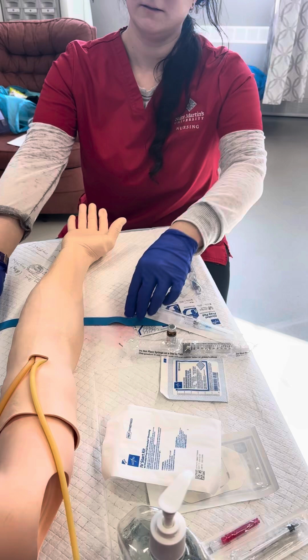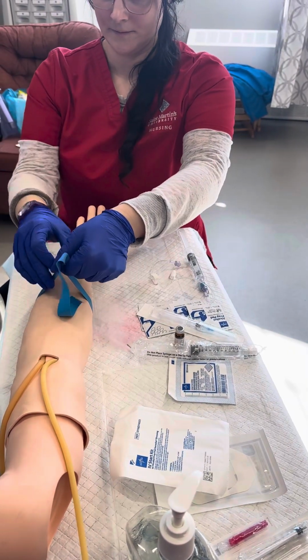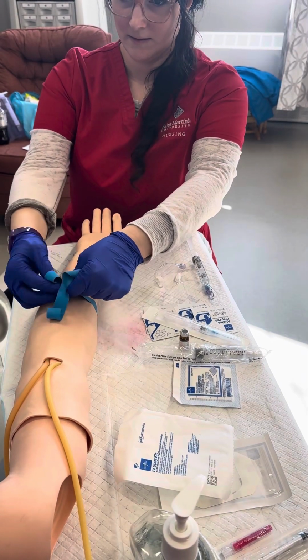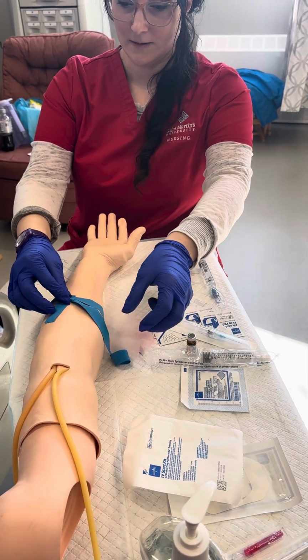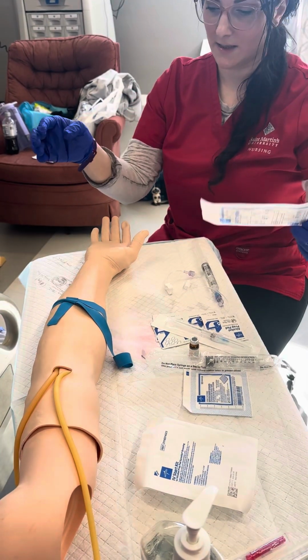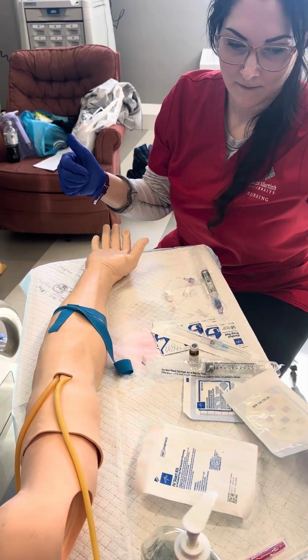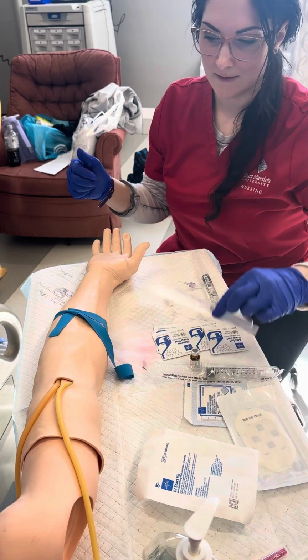Go ahead and go like that again. All right. I have my bandage here, and I have my date, then my initials, the type of catheter used, and the time. All right.